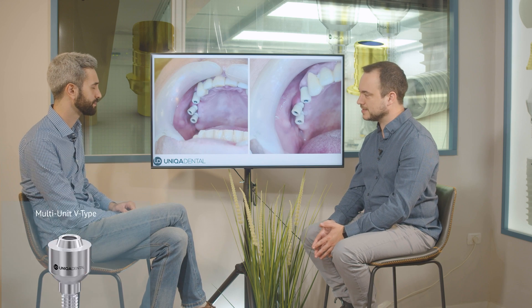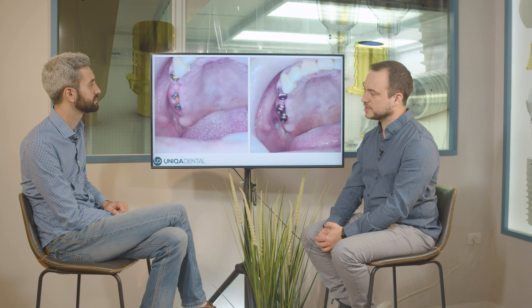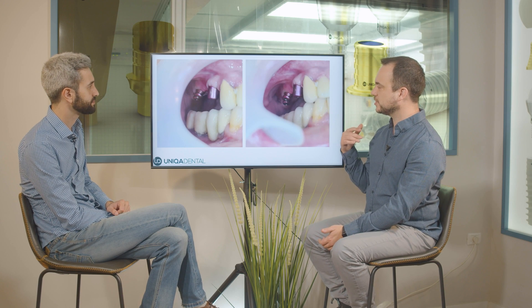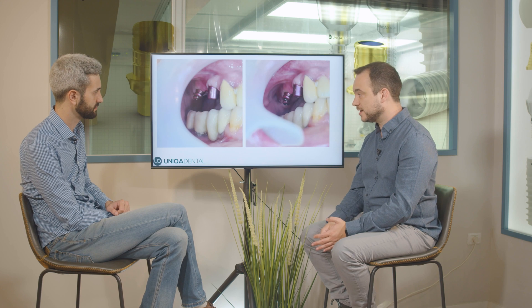Even with such a big angle, when you're using V-type multi-units you can use straight multi-units with a little bit bigger angulation — it still fits and everything is fine, because it has a smaller cone. You can fit even when you have 30 or 40 degrees of angulation. You can see the multi-units and the healing caps. For tooth number 14 we have an angulated multi-unit, and the other two are straight V-type multi-units with a small cone. The original angulation of the angulated multi-unit would be quite extreme, placing the screw channel right in the middle of the tooth — something you don't want because of aesthetics.